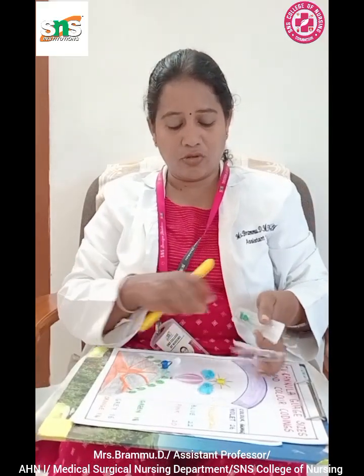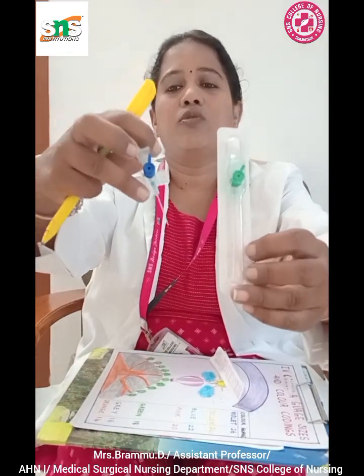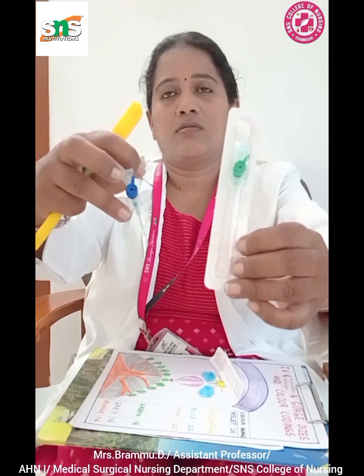Before I conclude my topic, I would like to go on to the mnemonics, that is the IV cannula size and color coding. I have only two right now to show you directly, that is the blue and the green. So what are this blue and green? You might be surprised, right?